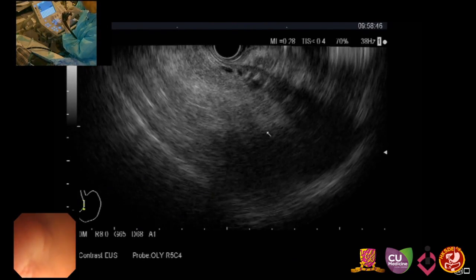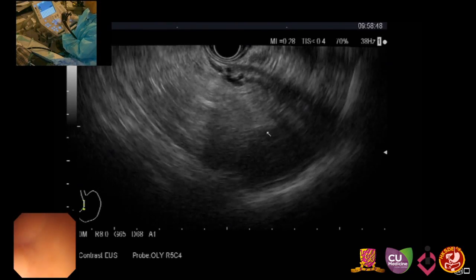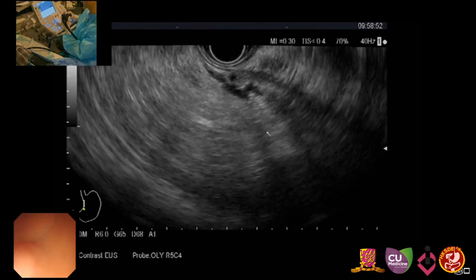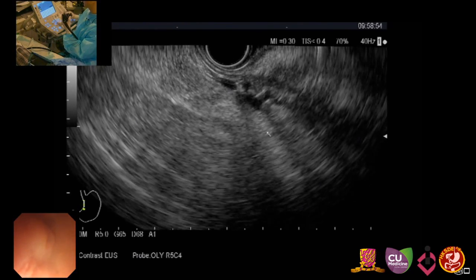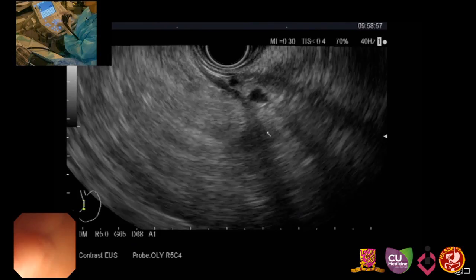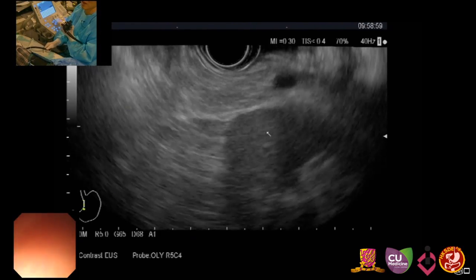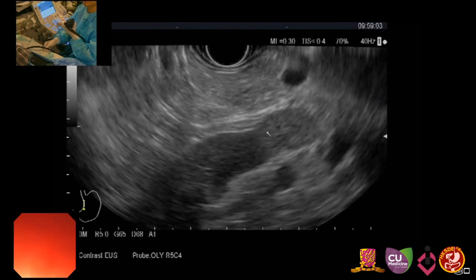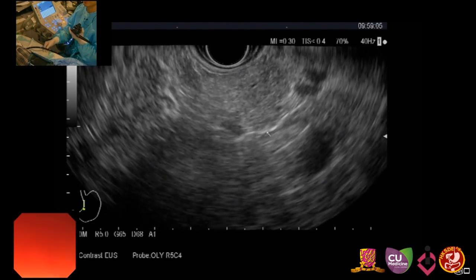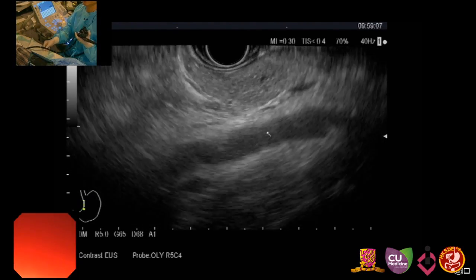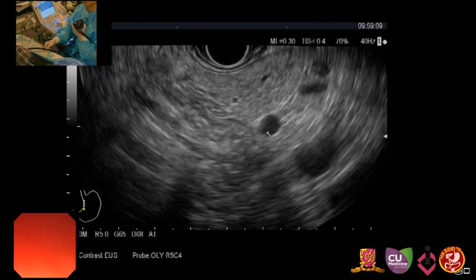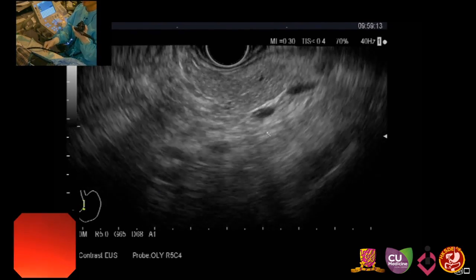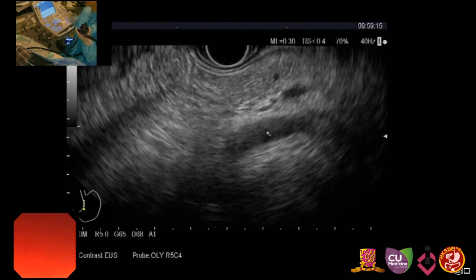We are focusing on the pancreas, so the range is very important. I don't need this wide view — to see the pancreas clearly I just need 4.5 to 5cm penetration depth. Now I can see the pancreas again, and the body and tail area is completely normal. I cannot see any abnormal structure here. This area here is the SMA.